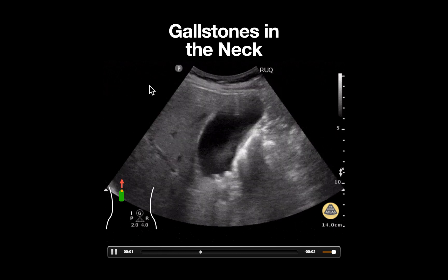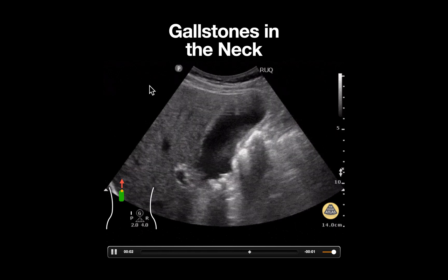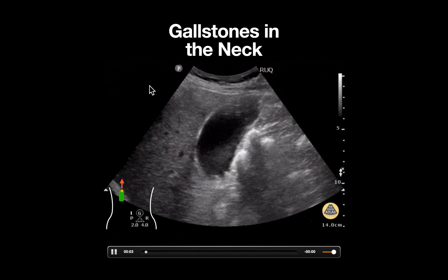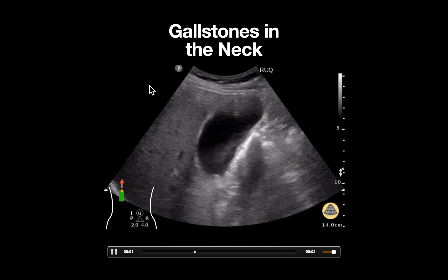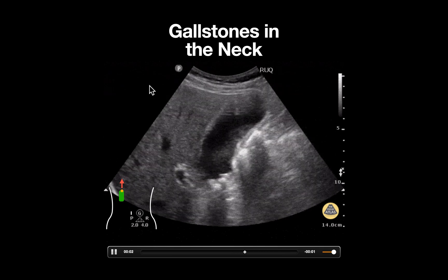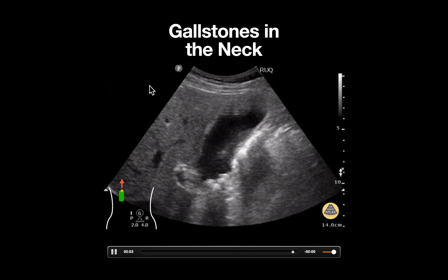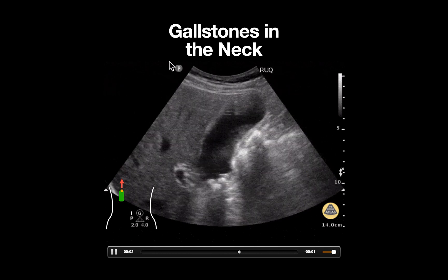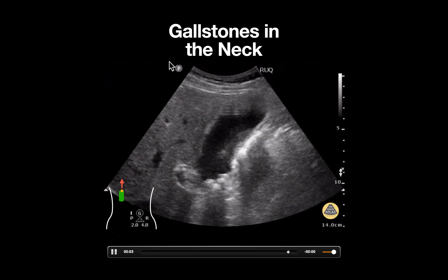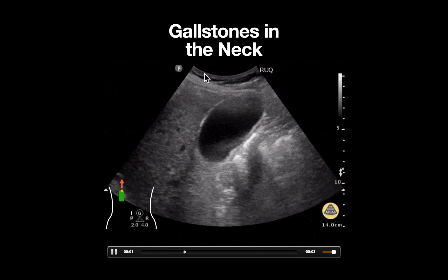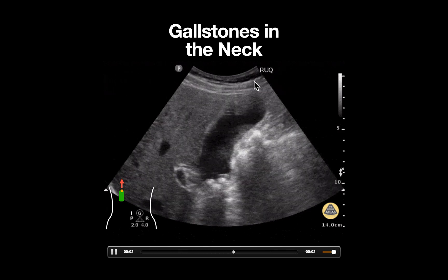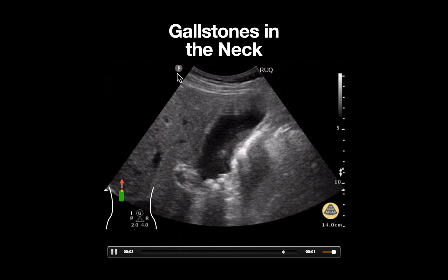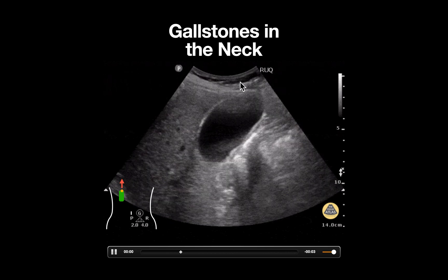This is an ultrasound clip demonstrating several small gallstones seen in the neck of the gallbladder. Notice that the probe marker is on the left side of the screen, and a curvilinear probe is being used, as delineated by the shape of the probe footprint at the top of the screen.